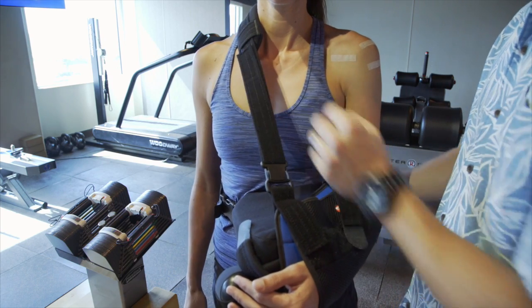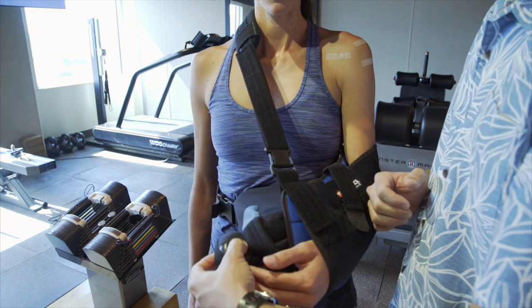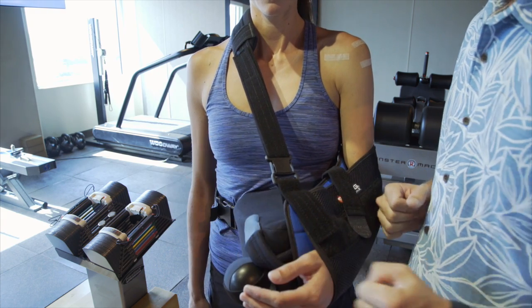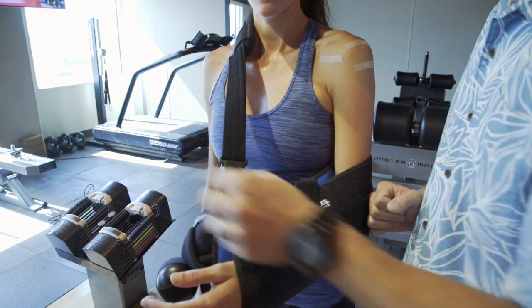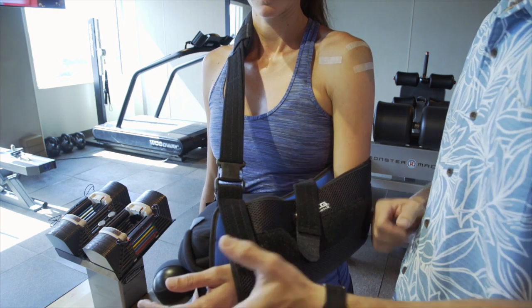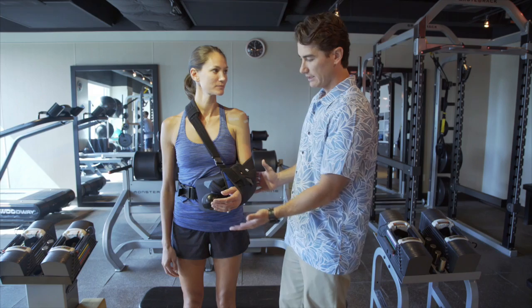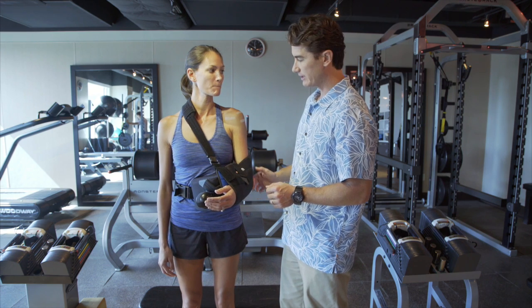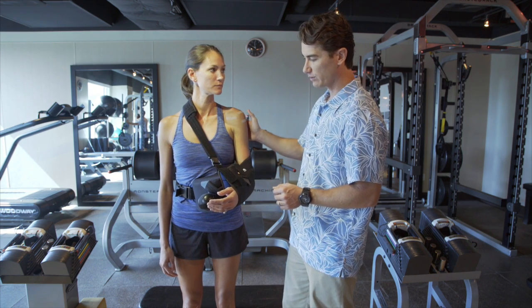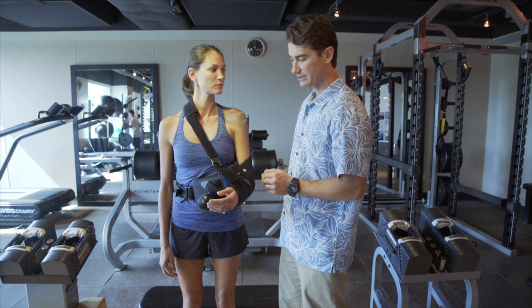That's how you take your brace on and off. You have a little squeeze ball to work out your hand if you want. If all these little straps bother you, don't feel like you need them — the main thing is that the pillow is keeping your arm at about a neutral position so your rotator cuff heals in the right place. To summarize: Steri-strips stay on for one week and you can shower over them, and we've gone over how to adjust your brace.